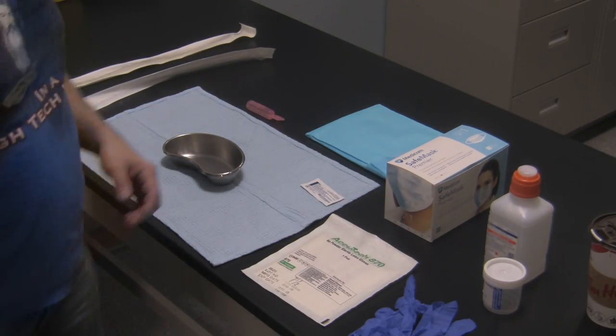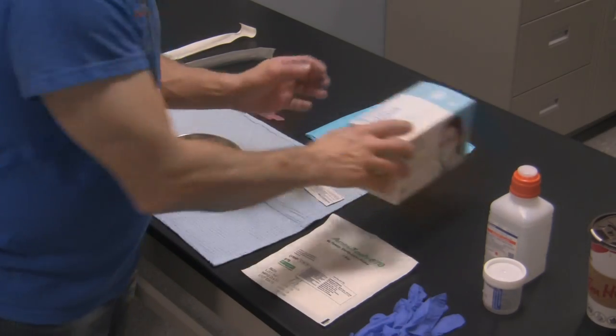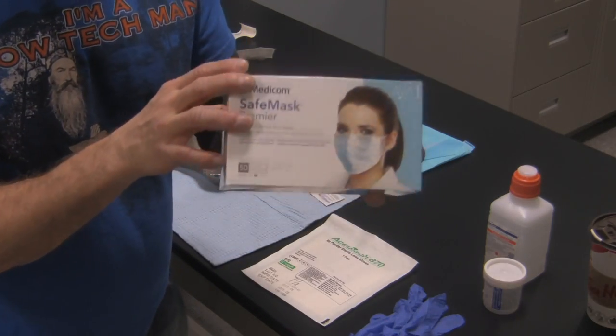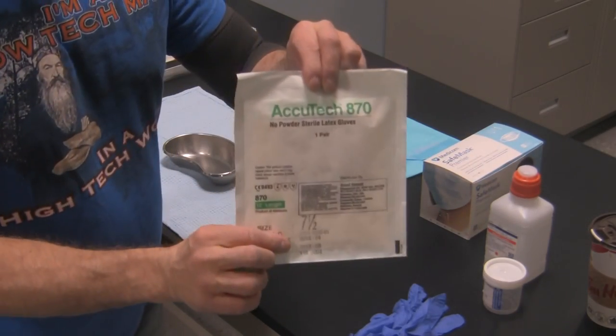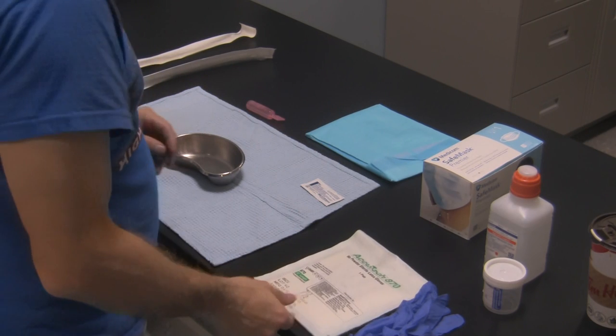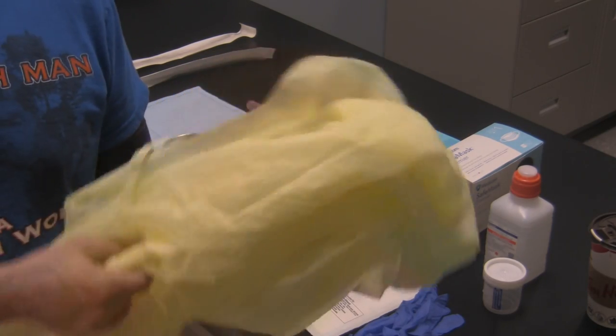Starting off with the PPE: obviously you're going to need gloves. You might need a mask, especially if you're doing sterile technique. Sterile gloves if you're doing sterile technique, and of course you may want to protect yourself depending on what reaction you get from the patient — so some sort of gown.